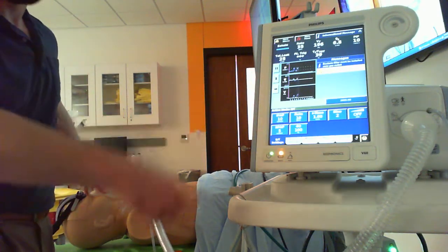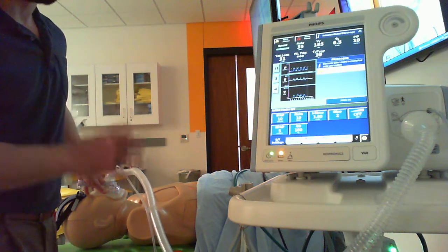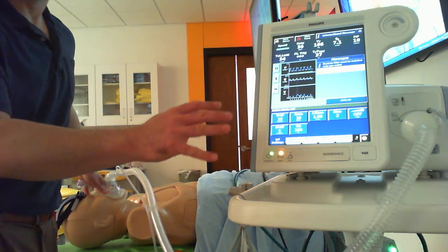Likewise, this machine is trying to measure the baseline leak to be able to effectively notice when a patient's trying to trigger, all right? If you don't have a good seal, your volumes are going to be inaccurate, and your patient may not be able to trigger here, okay?